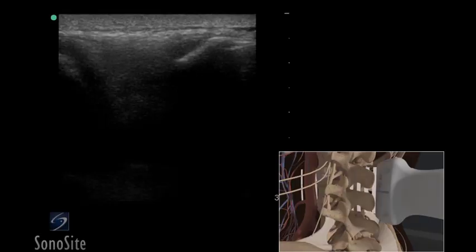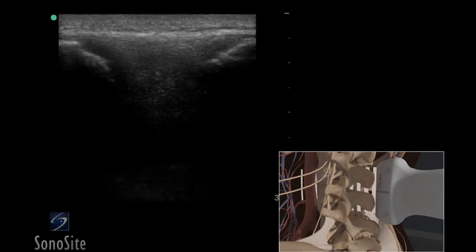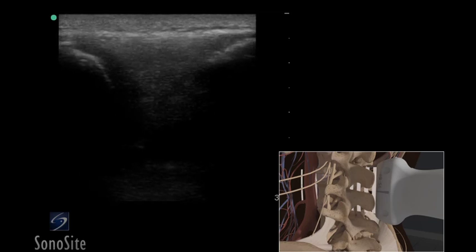The two previously identified spinous processes will now appear as crescent-shaped, concave, hyperechoic structures. The gap between the bright hyperechoic convexities is the inter-spinous space and defines the area in which the lumbar puncture should be performed.